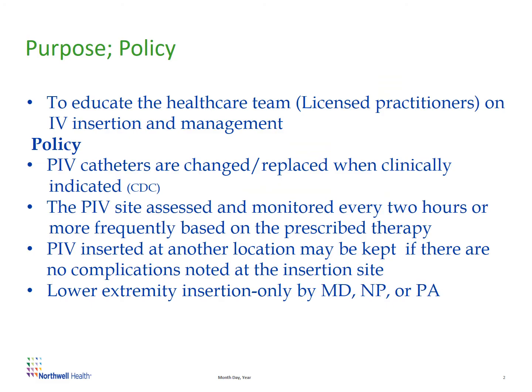The purpose of this presentation is to educate the healthcare team, which is the licensed practitioners, on IV insertion and management. The policy related to IV insertion and management is given below, and this is again a summary of the policy. So the PIV catheters are changed or replaced when clinically indicated. This is as per the CDC guidelines.